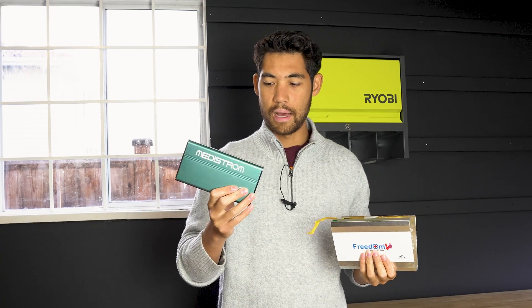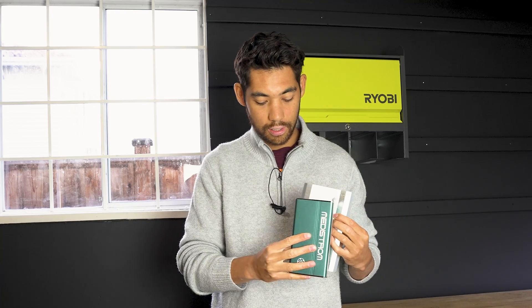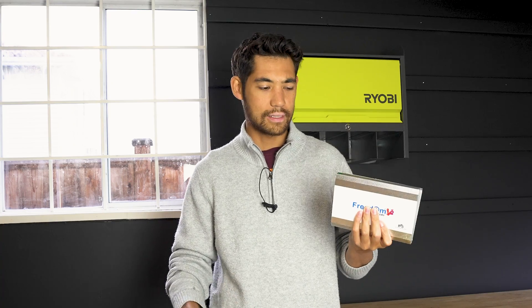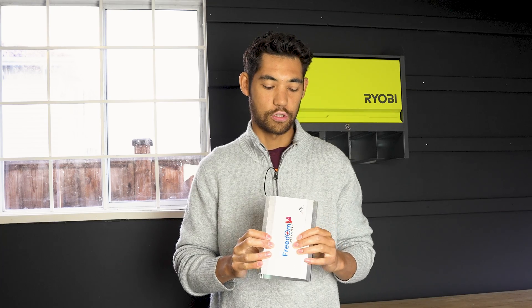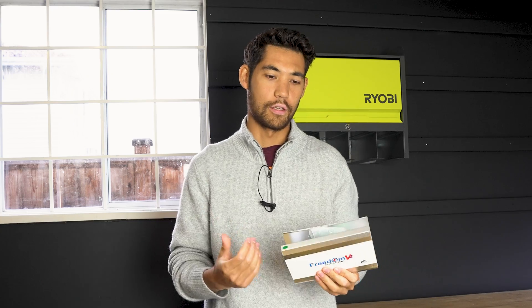This here is the Medistrong battery, and this is 95 watt hours. As you can see, the Freedom battery is quite a bit larger. So I was trying to figure out how they get so much capacity out of a battery, and also why is it larger — perhaps there's actually more to it than meets the eye. So after weighing them, trying to figure out why it's heavier, larger, and having the same capacity, I kind of came to the conclusion that perhaps they were lying about the watt hours in their battery.